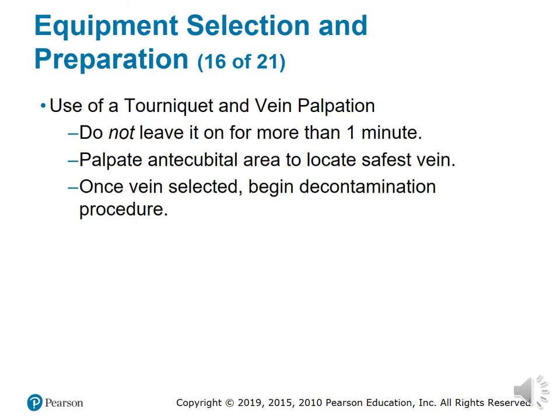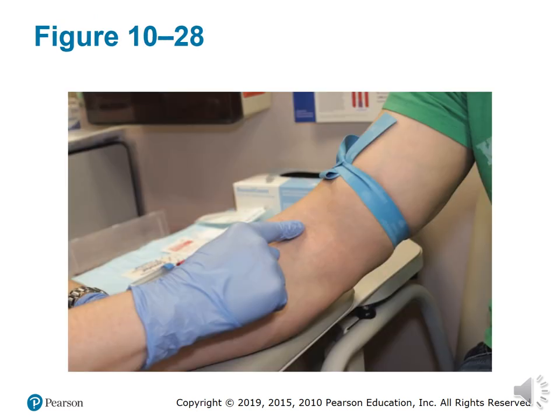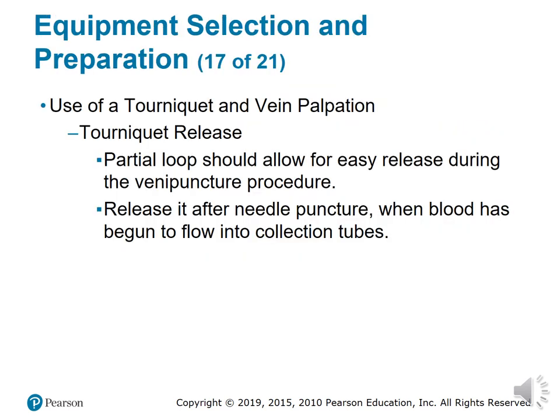Right. Do not leave it on for more than a minute. Palpate the antecubital area to locate the safest vein. Once vein is selected, begin decontamination procedure. Right here you see palpating of the vein, tourniquet tied. Right. Tourniquet release.